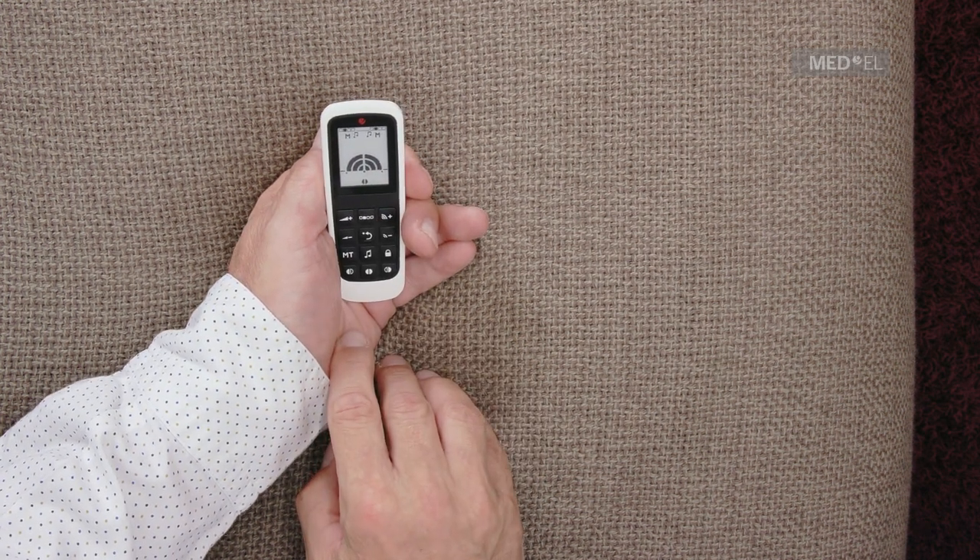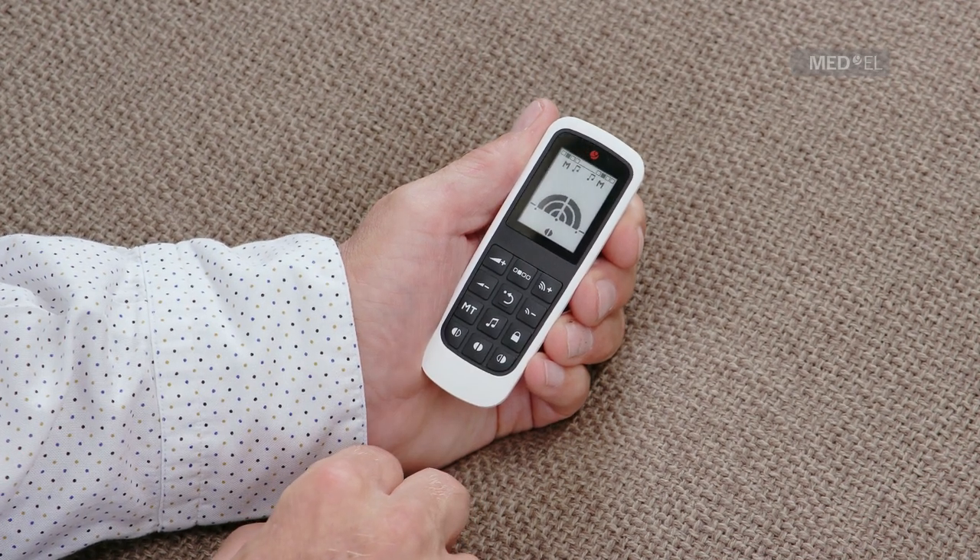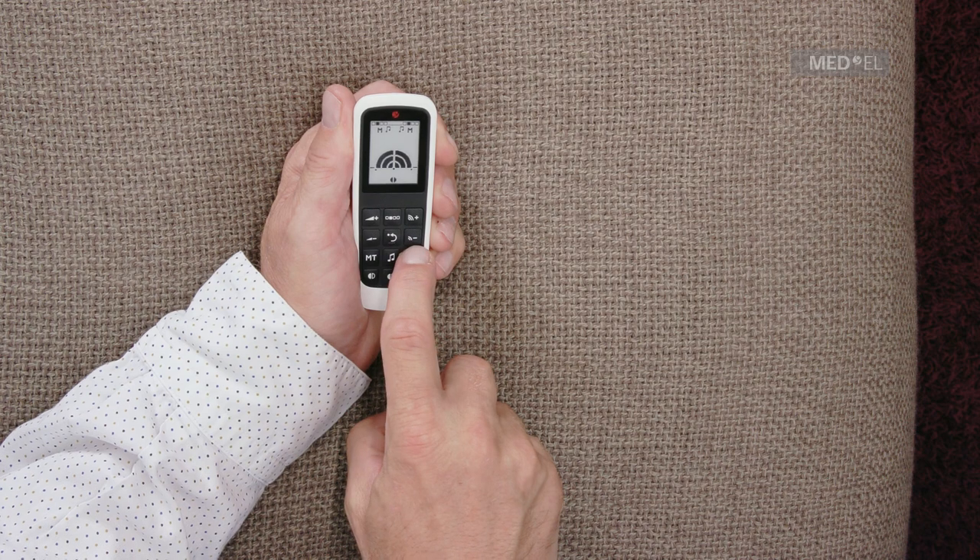To activate the connection with AudioLink, press the AudioLink key. To lock your keypad, press the lock symbol for a couple of seconds.